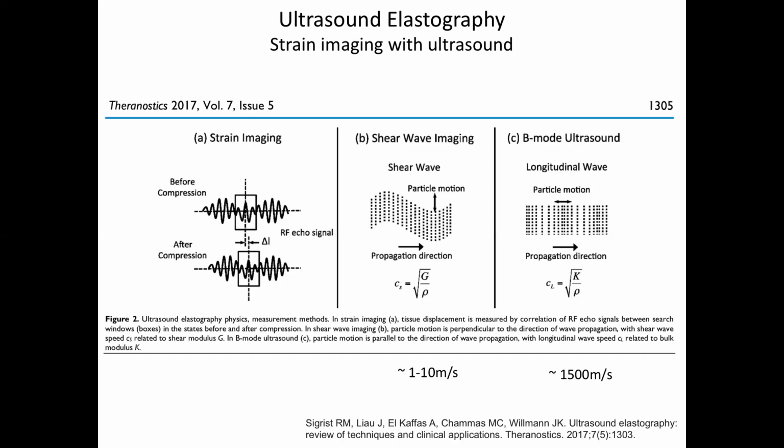Another way is I'll take my ultrasound transducer and continuously acquire my images while I press down on the tissue. Say I have it on the patient's liver, and I push it down, so I squash the liver, right? Then you take those difference images between the pre and the squashed liver. If you have a mass in there that's stiff, the tissue around it squishes more than the mass, and so it stands out, right?